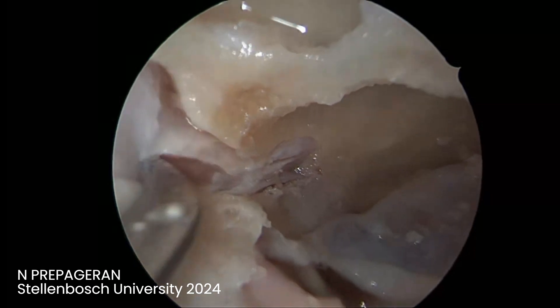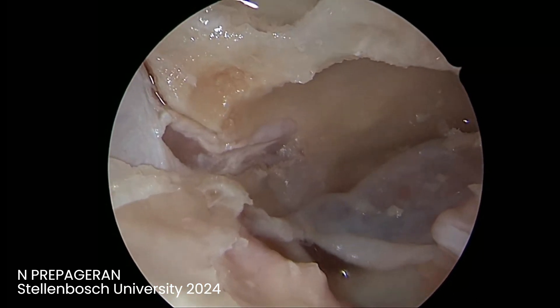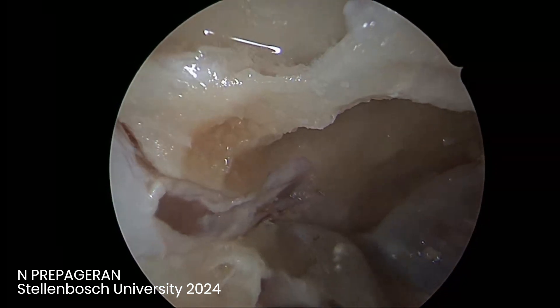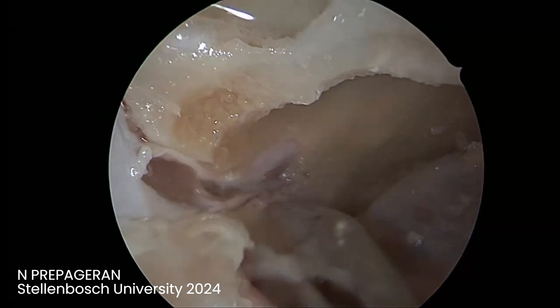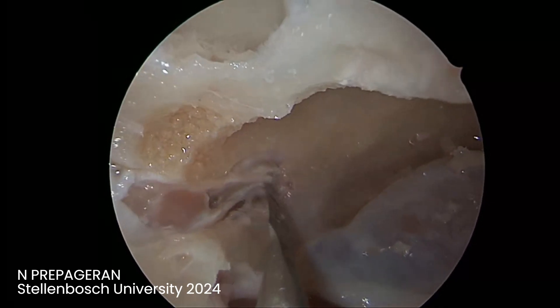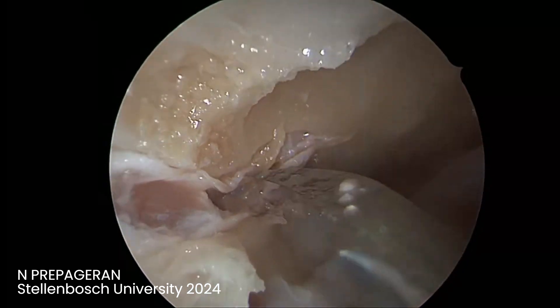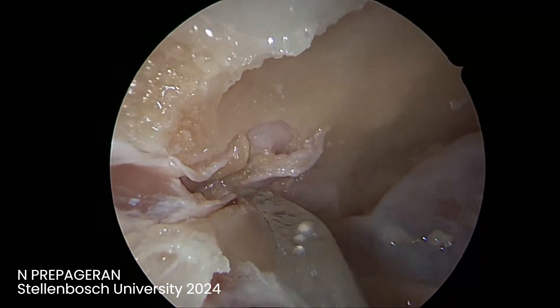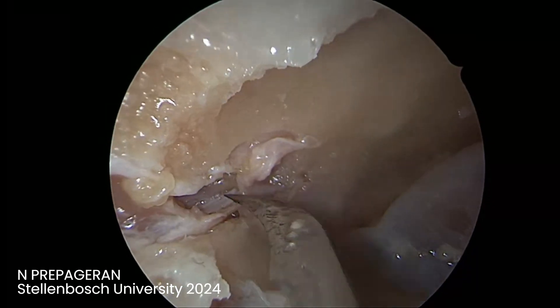You will see how thick the sheet is until you are able to see the muscles at the cone. This is the muscle attachment at the ligament of Zinn. You have to cut the ligament of Zinn until you are able to see the muscle. Can you see the white structure? That's how much you need to cut to see the optic nerve. It's very difficult to injure the optic nerve during surgery because there are a lot of structures you need to cut before you reach it.